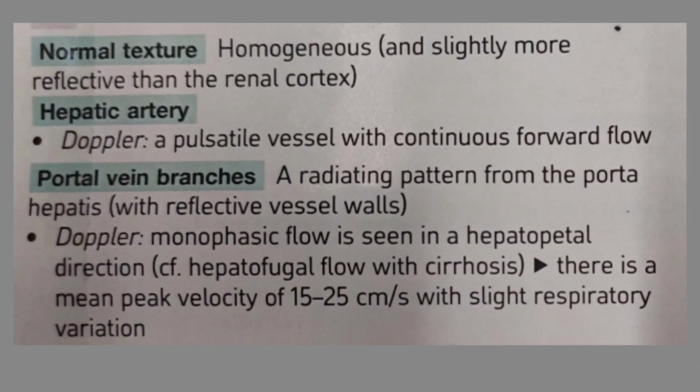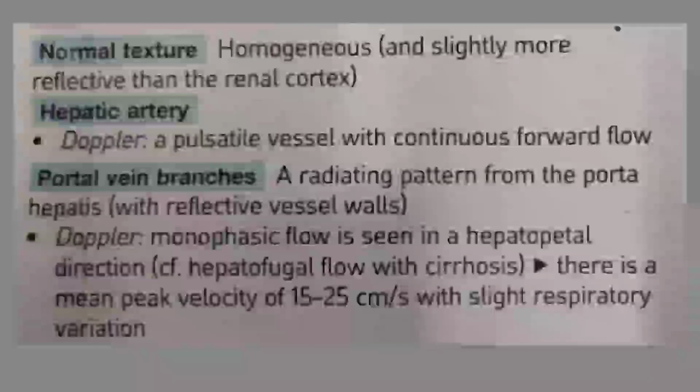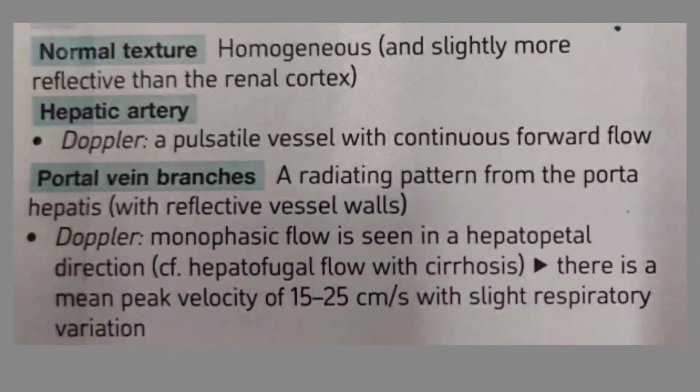So on ultrasound, analysis of liver parenchyma, liver homogeneity, portal vein branches, and hepatic artery leads towards pathological processes and helps us to diagnose certain abnormalities.